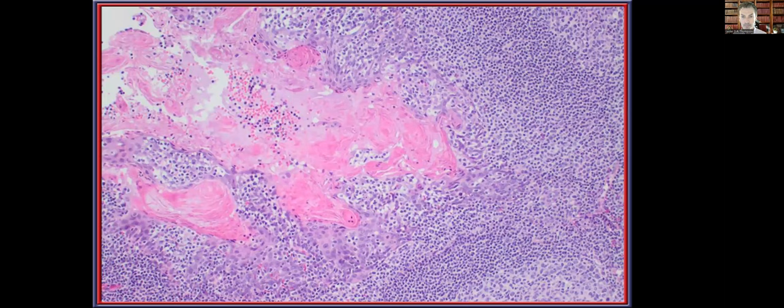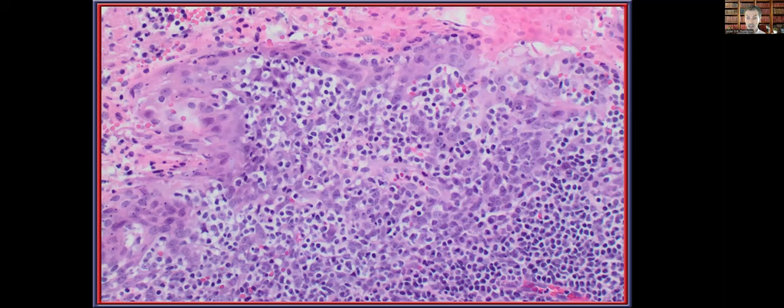Normal tonsillar epithelium has an incredibly intimate relationship with the lymphoid component — it is very difficult to tell where the tonsillar epithelium begins and ends and where the lymphoid component starts and stops. Another key point is that there is no evidence of a basement membrane, and for this reason the concept of an in situ lesion for the oropharynx is negated, because you cannot tell when invasion has occurred beyond a basement membrane that does not exist.